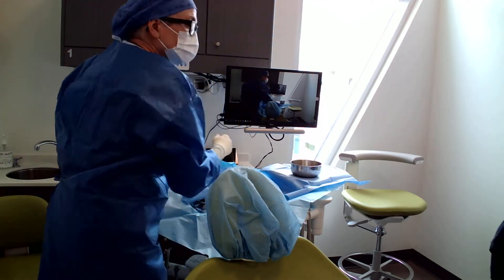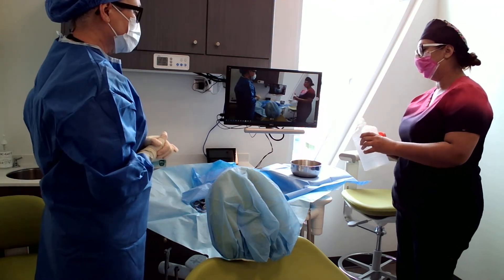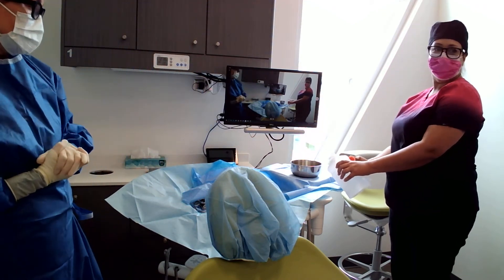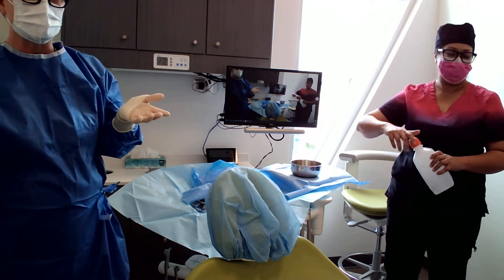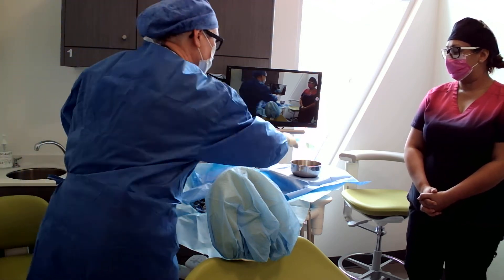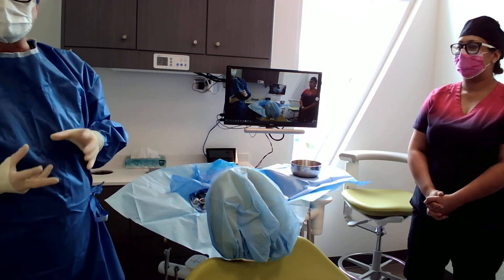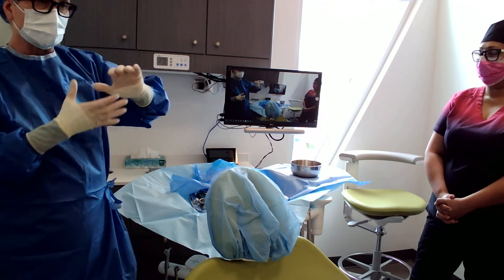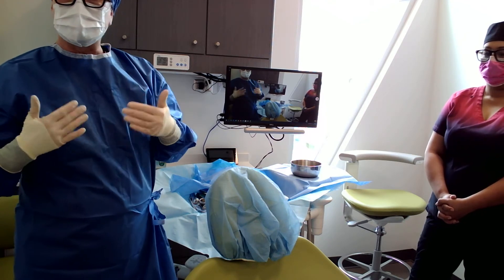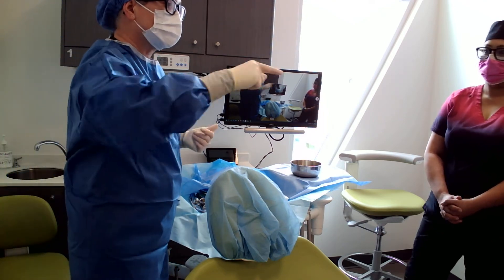Nina, I'll have you pour some sterile saline in there. We opened this bottle this morning, but normally for each case it would be a brand new bottle. If Nina accidentally touched the side of that bottle to the bowl — it's gone. Because the outside of that container is not sterile. So then I would fill up all my irrigation syringes. I have all my 4x4s. We use a 4x4 as a moist throat pack — I moisten it in sterile saline, wring it out, and it goes in the back of the patient's throat because when you're asleep, you have no gag reflex.